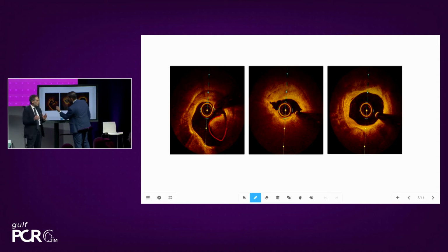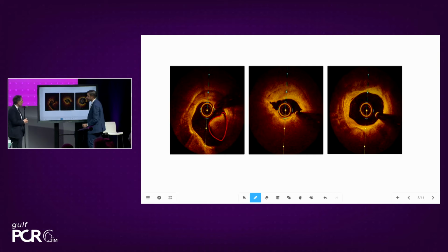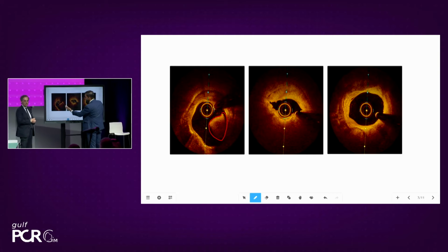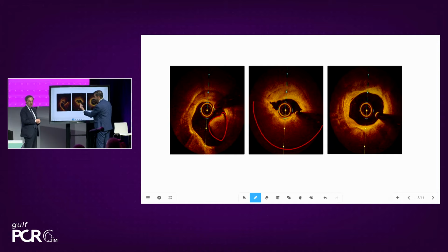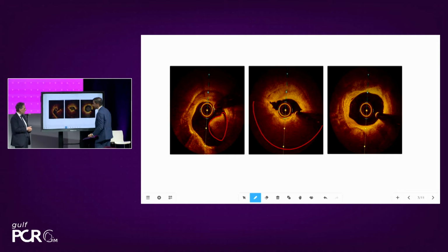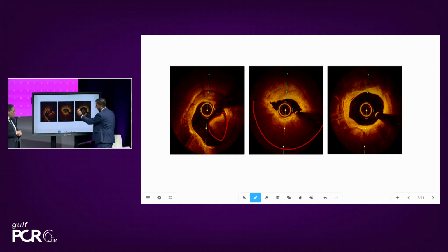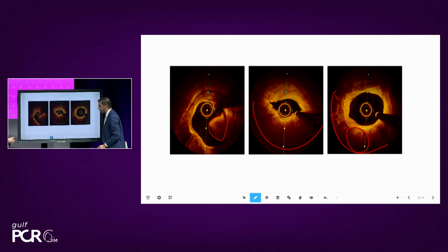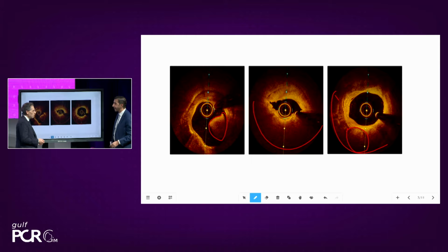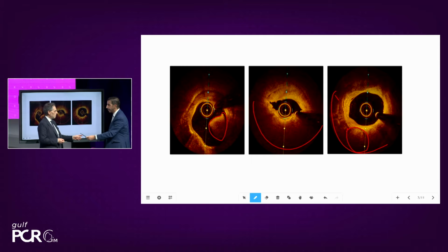Yes, so here we can see the thrombus. This is how it appears inside the vessel, protruding in, with a different appearance. Here we see an arc of lipid core extending across the bottom, with far field loss through the lesion. And here we can see the calcium with a nodular calcification right here. So we are able to identify the different pathologies in this case.